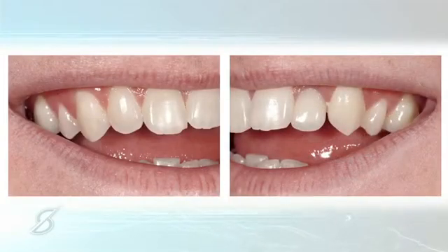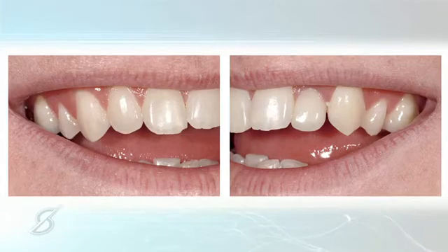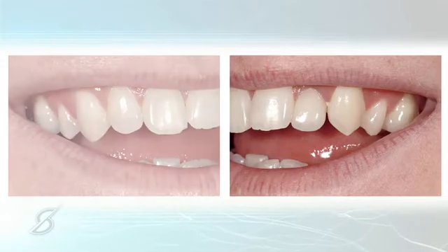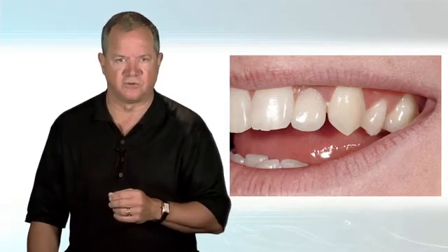Now, the first question that you'd want to ask yourself is, how do you know you're going to be able to get that tissue up far enough? And the answer is you better look at a radiograph, because what you want to see is that in fact this implant is apically positioned far enough that you actually will be able to extend contour. Now, typically that's not a problem. Most implants aren't too shallow. But once in a while, one in fact isn't deep enough to allow you to get a normal gingival form.